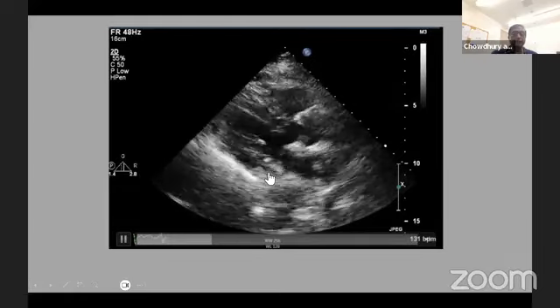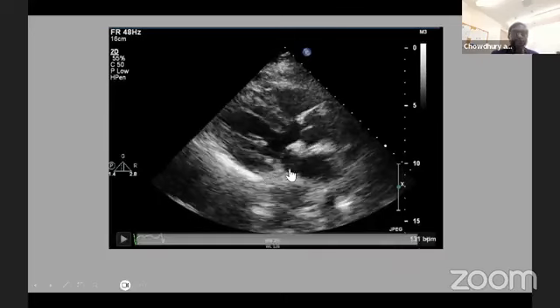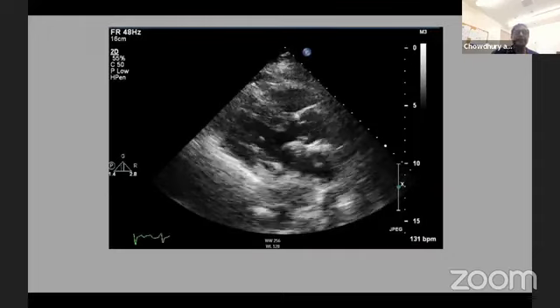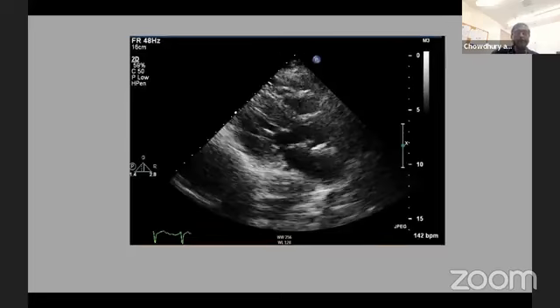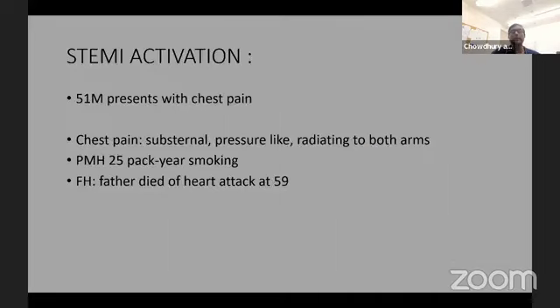And you need to tell the ER physician that this is the EKG suggestive of that, but profound anemia and hypoxia are giving this. And that can be a mimic. So it is not recommended to do STEMI activation on the basis of that kind of left main equivalent EKG. I think it should be a dialogue among physicians and the clinical context rather than just giving lytics. This is very important, that I wanted to make the point.